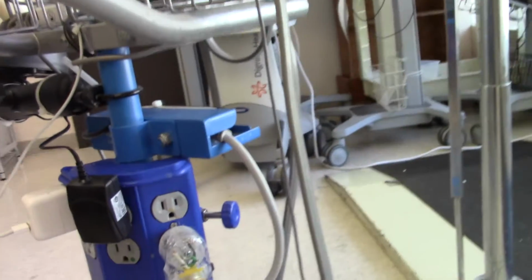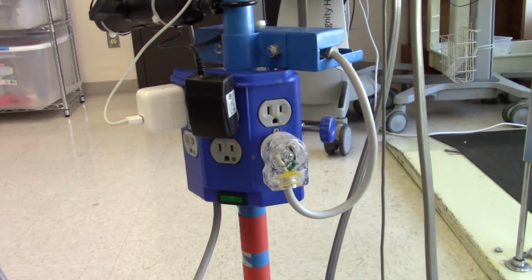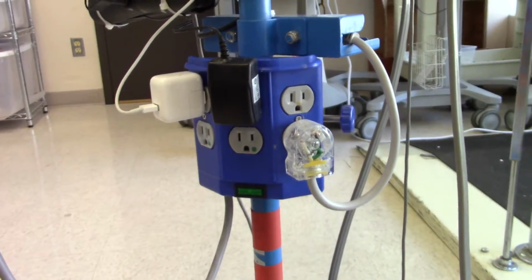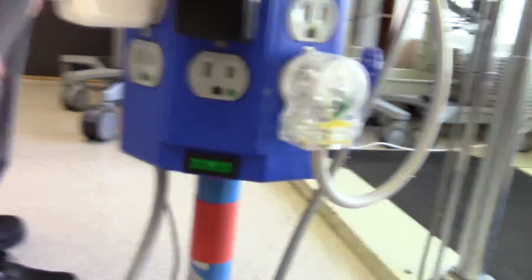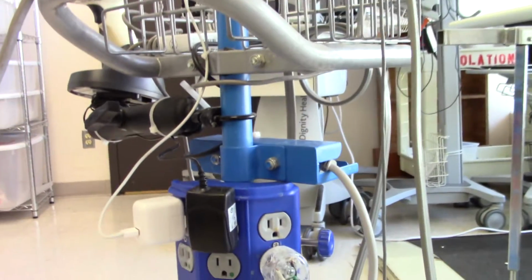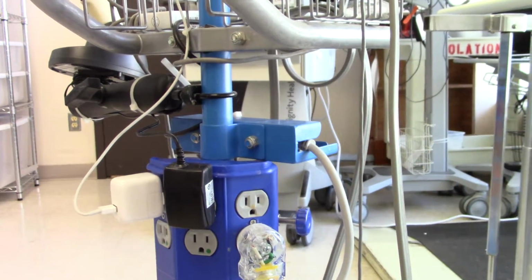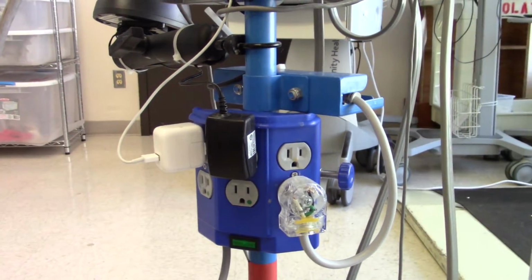Now here you've got a different power strip, yeah. Biomed sourced that. I think that was GCX or someone they got that from. I'm not sure, there might be a part number on it. Okay, and do you encounter the same problems with these? People steal sometimes. Yeah, the bricks, it's the same thing where you have this unprotected cable hanging out back, so it gets damaged or is easily stolen. Chargers are a pretty high theft item in the hospital.